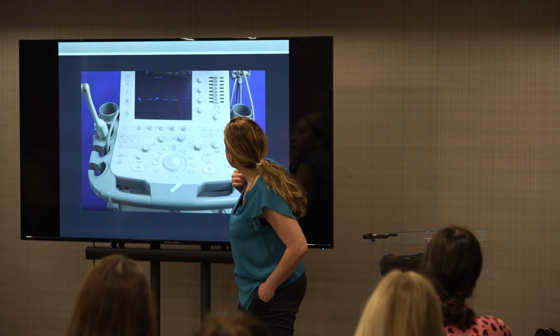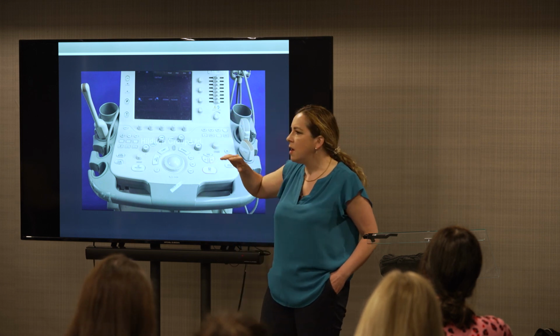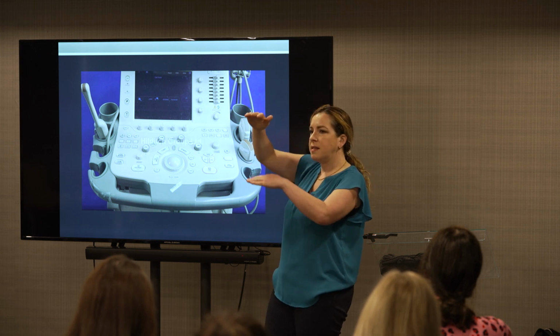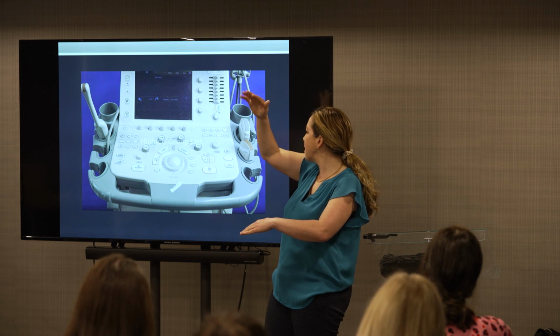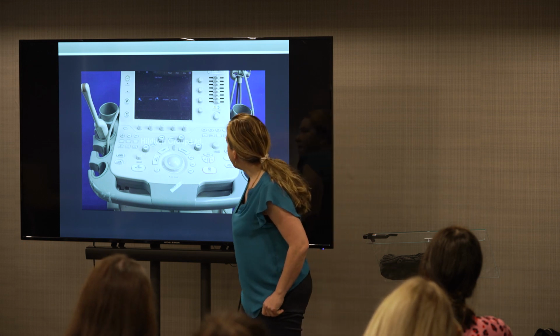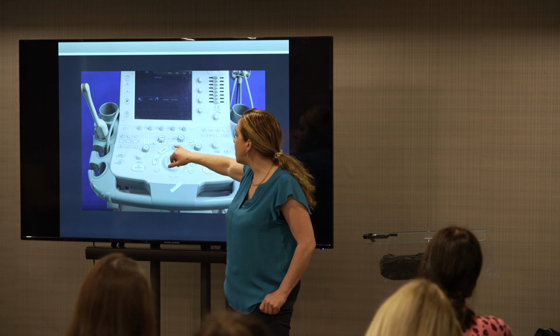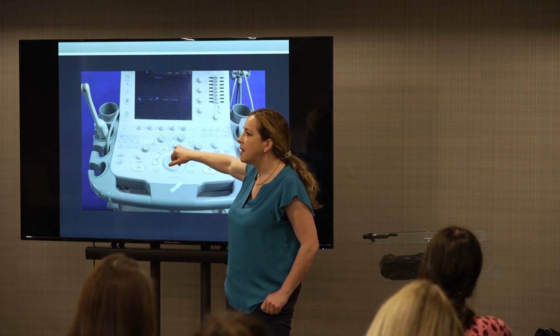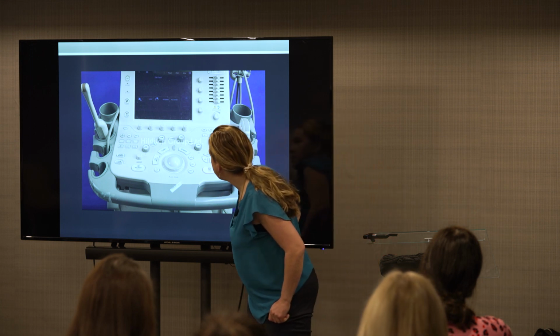So you've got to fiddle with it to get the right kind of level. The depth is a very important button, which would be this one, I think, on this machine. So you're increasing the top to bottom length of the image. And the other one, which I use a lot, but some machines have an autofocus. I really like an old-fashioned focus, so it's this button on this machine. Focus is important. I'll show you an example why.